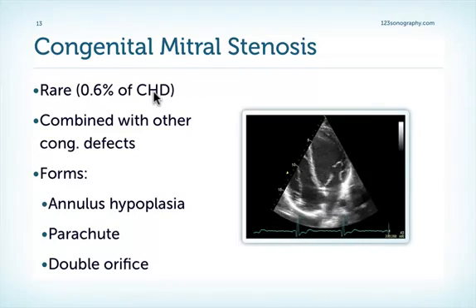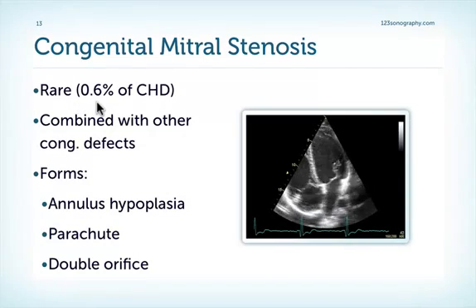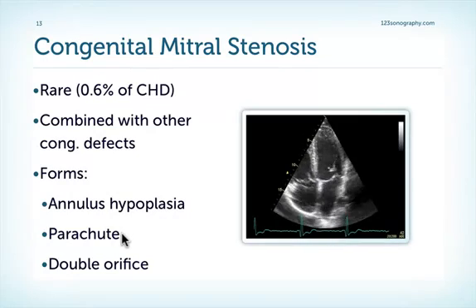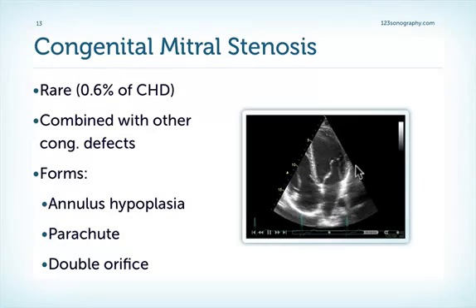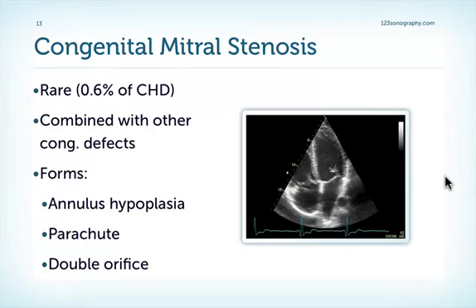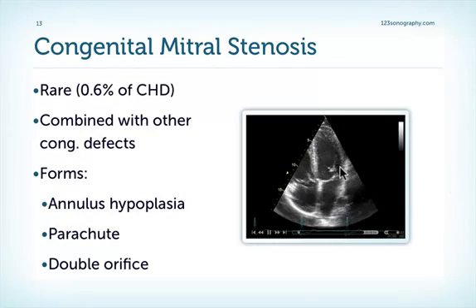The third cause of mitral stenosis is congenital malformations of the mitral valve. They're very rare and usually combined with other defects. Three typical forms are annulus hypoplasia, the parachute mitral valve, and the double orifice mitral valve. Here's an example of a parachute mitral valve, characterized by a unifocal insertion of the mitral valve leaflets. You can see there's a funnel-like stenosis, which is only mild in this case. Patients do not have to have mitral stenosis in parachute mitral valve, and we also see a strange motion of the valve resembling that of a parachute.